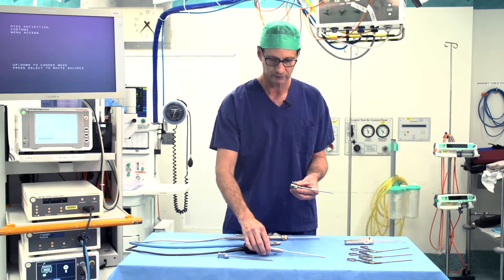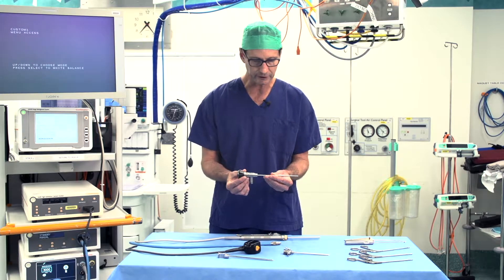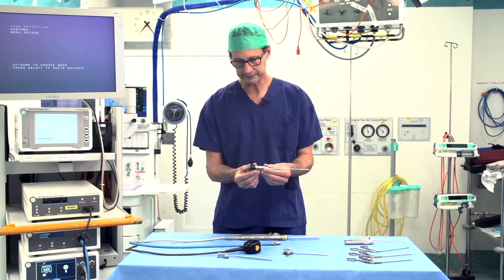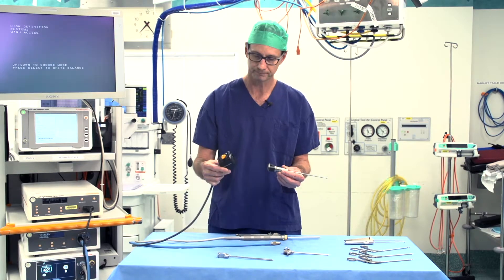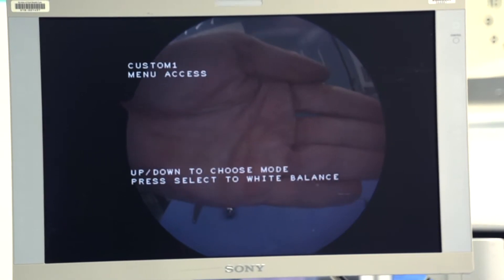Then in that cannula, we put our telescope. So this is the arthroscope. It has a lens at the end. Connected to that is a camera, which will transmit the digital image to our screen.